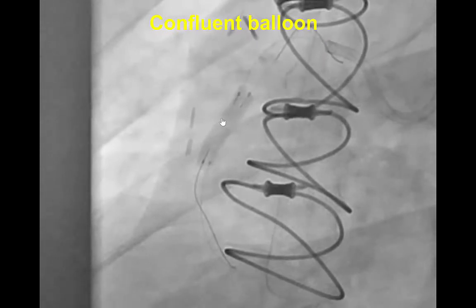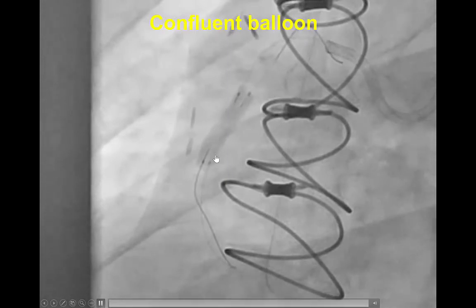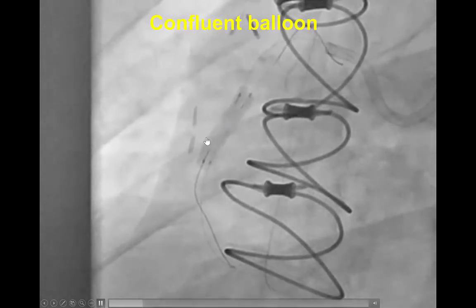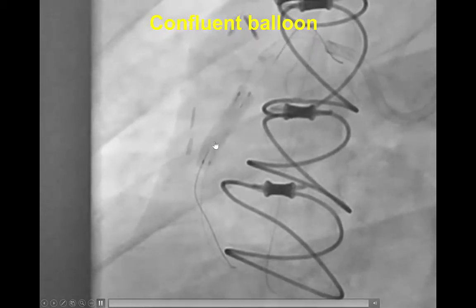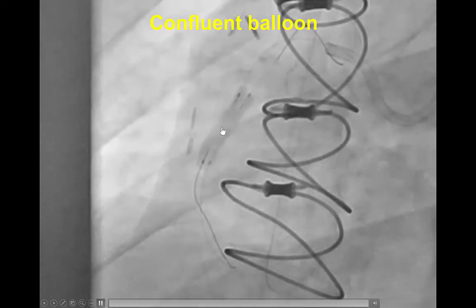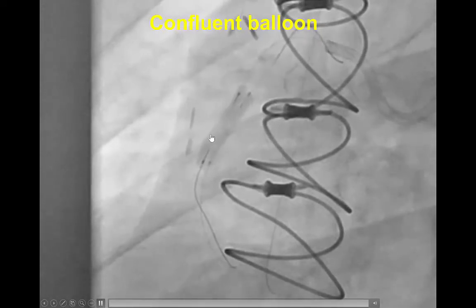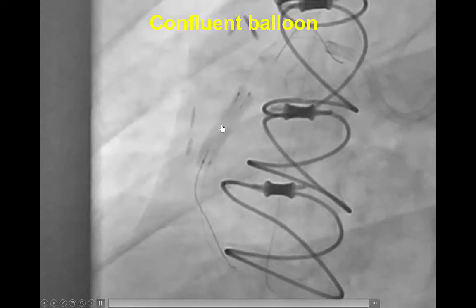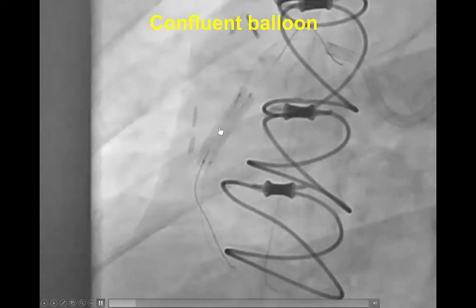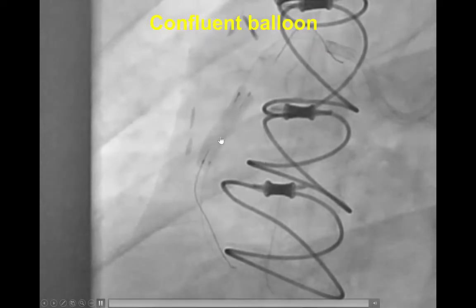We then performed the confluent balloon technique, in which we advance a retrograde balloon over the retrograde guide wire and an antegrade balloon, which are inflated simultaneously in the same location in the mid-right coronary artery. By doing that, we achieve those two subintimal spaces merging to create one larger space. This may be hard to do when the collaterals are small, but here, since we had a vein graft, it was fairly easy to advance a retrograde balloon and place it side by side with an antegrade balloon catheter.